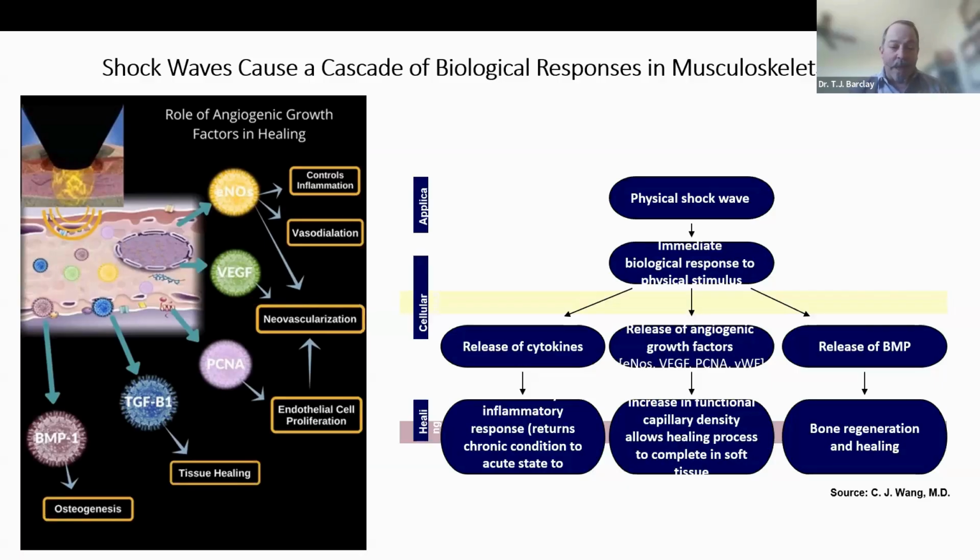And then the last category of cytokines involved are related to bone healing. So when we talk about treating things like fractures and osteotomies, Shockwave will upregulate some of the cytokines involved there that will result in faster bone deposition in those injuries.